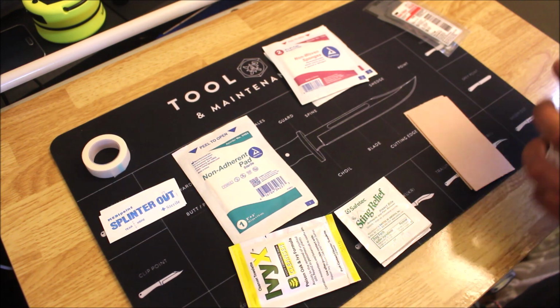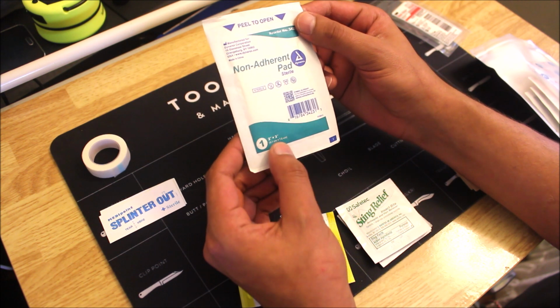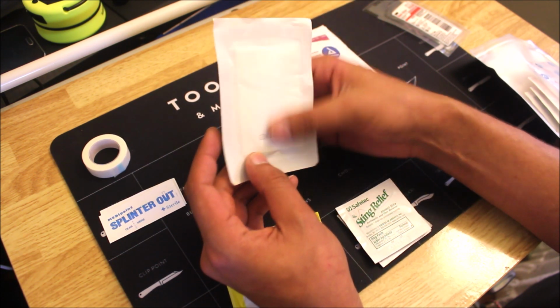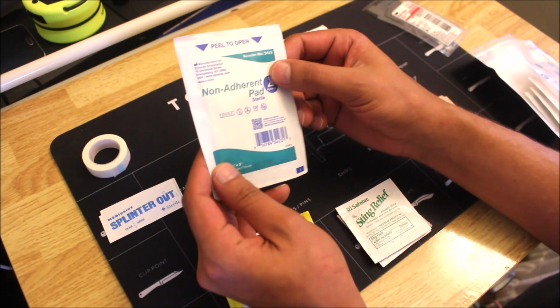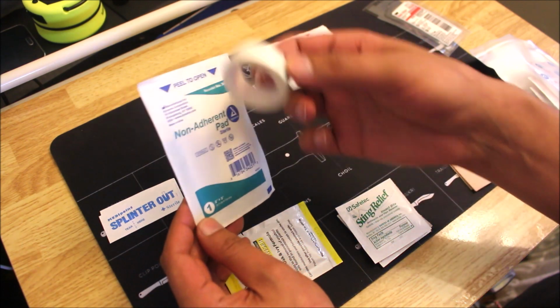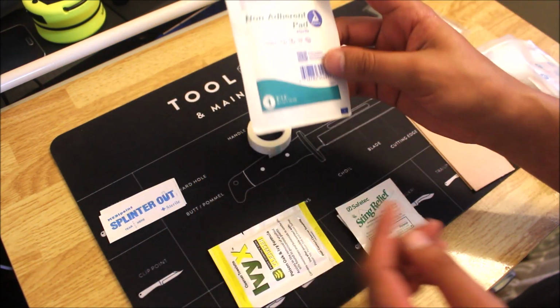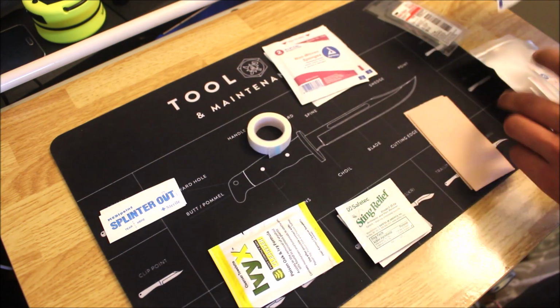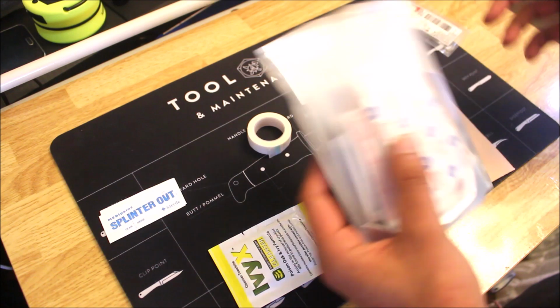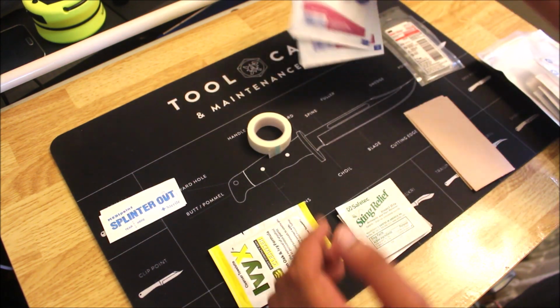Head back down in the pack. Right here it says a non-adherent pad, which is sterile. It's 2x3, which is like a little gauze pad, I would assume. Non-adherent. So that's good to have. In company with the tape, you could put this down, tape it up, and seal up a wound at least a little bit. Definitely good to keep dirt and debris out, again, to prevent infections.